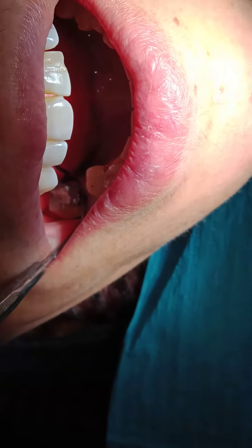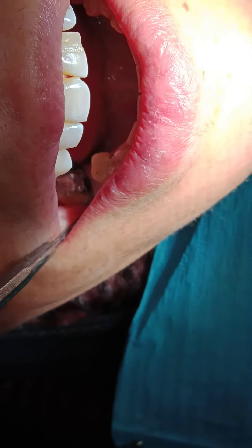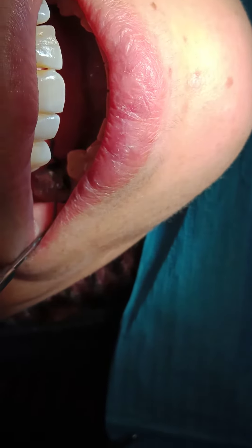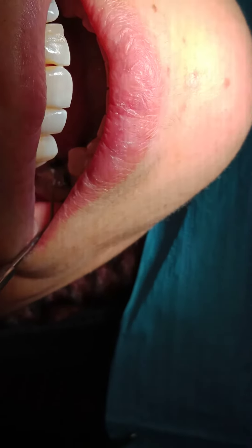Because it was placed dry, make sure you wet it before you remove it. If there was not enough crevicular fluid to wet it, it will drag the lining epithelium of the pocket and it will cause bleeding. So wet it before you remove it. Thank you.